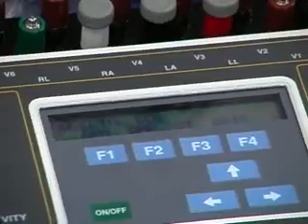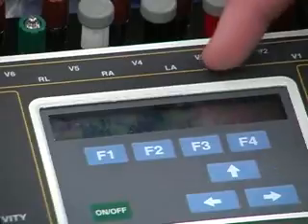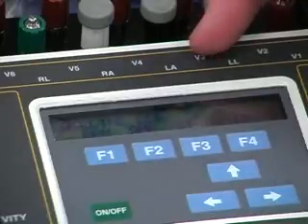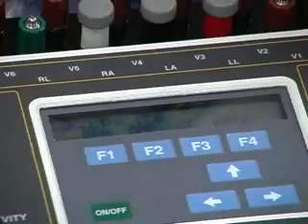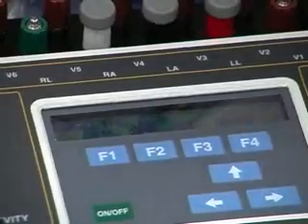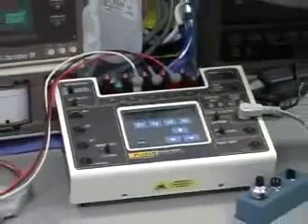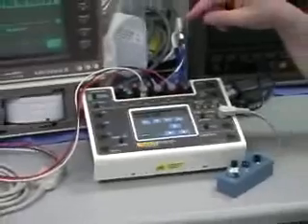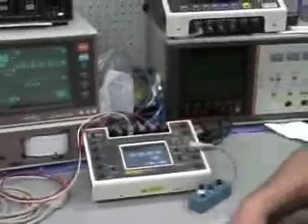At a setting of 1 millivolt for the R wave amplitude, we will do 0.1 millivolt elevations and depressions from 0.1 all the way up to 0.8, in the positive and the negative direction. And also we will do 0.05, which is one of the threshold levels for the ST segment set by GE Medical for their silent ischemia systems. So even something as fine as 50 microvolts, that they want to be able to measure, we can simulate with this.